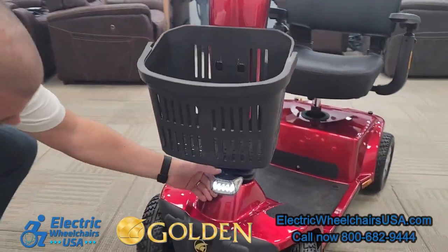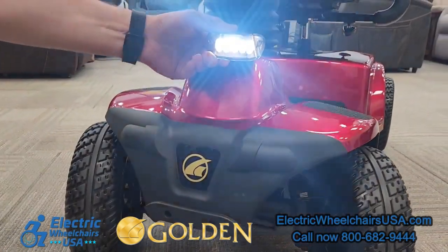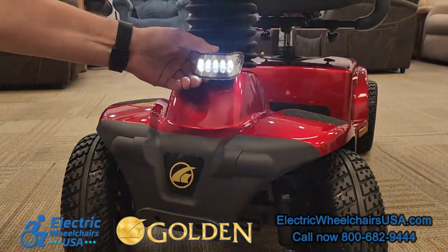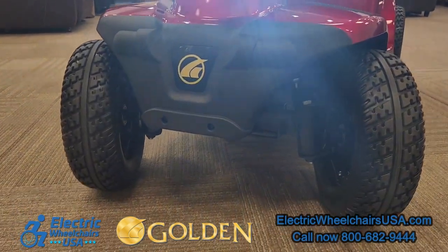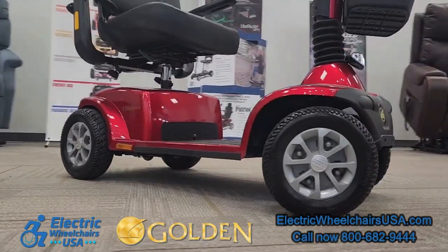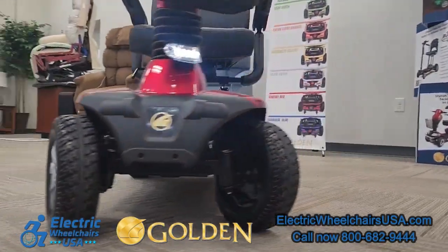This is the front headlight. You can see it's pretty bright and it is adjustable, so you can put it at the right positioning for you when you're driving at night. The Companion also has large 10-inch tires on both the front and rear.